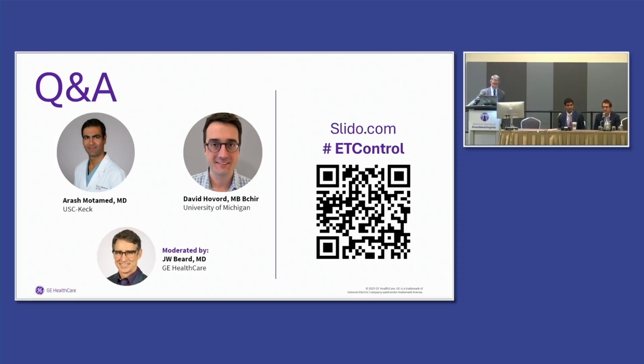Yeah, I mean, it shows you what it's doing. So in some ways, it actually makes it easier for people to understand the concept behind low-flow anesthesia. One of the things that we struggle with is trying to help people understand that you've got this system, you're putting gases into it and gas is being taken out of it, and you have to balance the two. And the lower flows you do that, the harder that gets to do. But you can actually use this device to help educate.